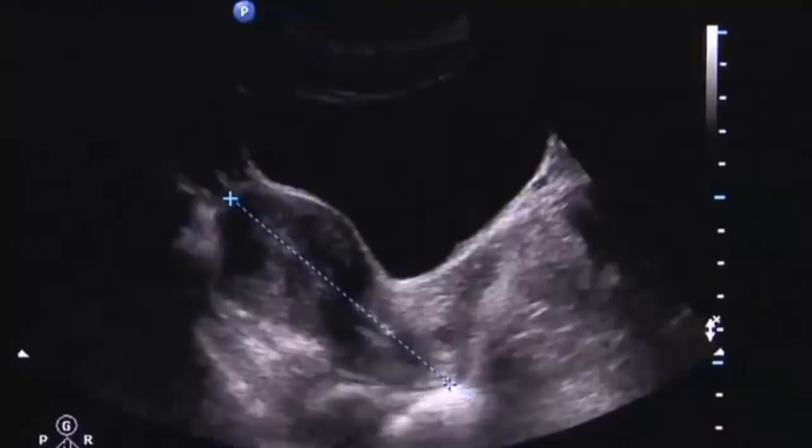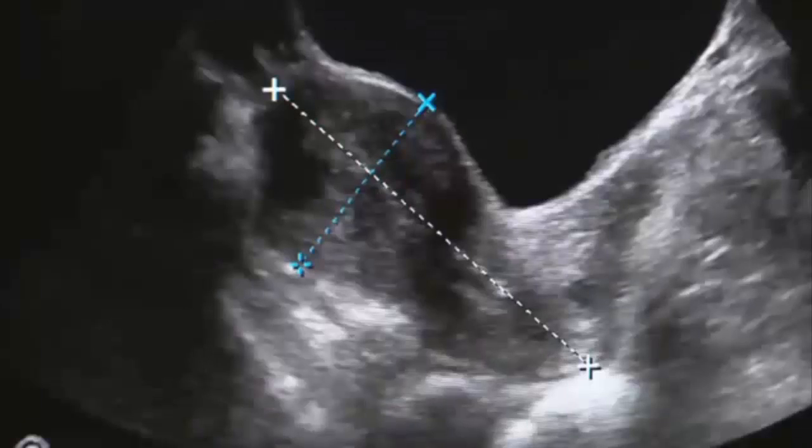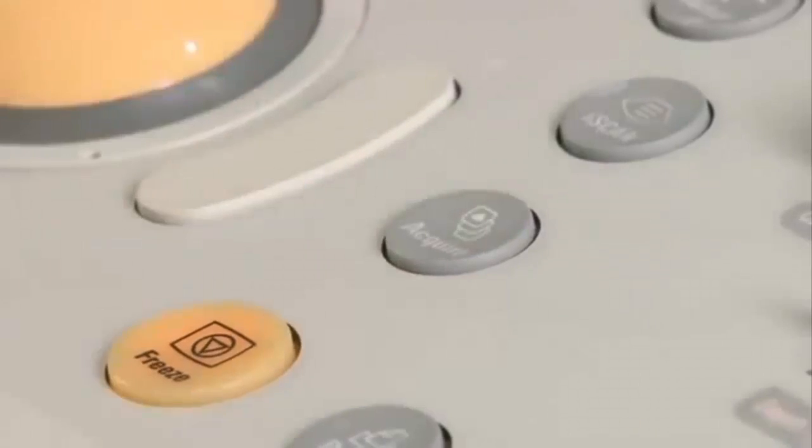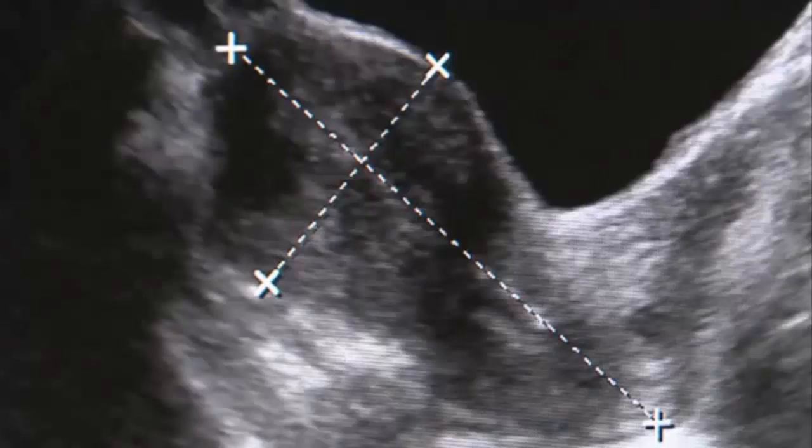Measure the long axis of the uterus from the fundus to the cervix. Measure the anteroposterior, or AP dimension, perpendicular to the long axis at the thickest part of the uterus. Then save the measured uterus image.